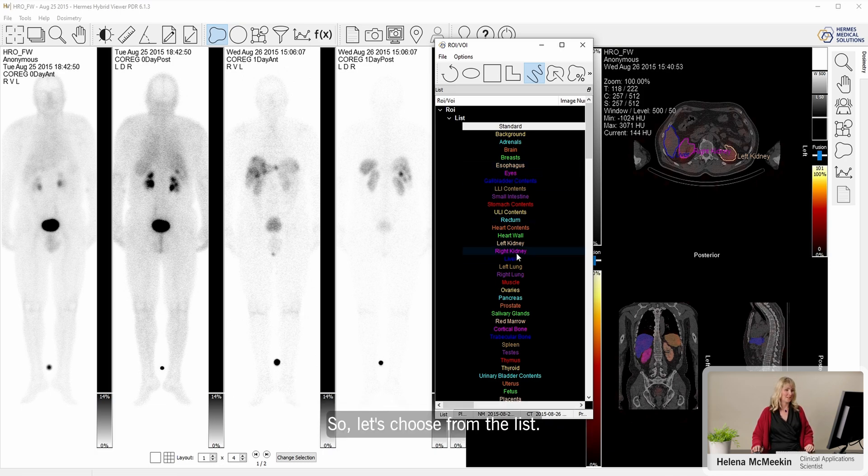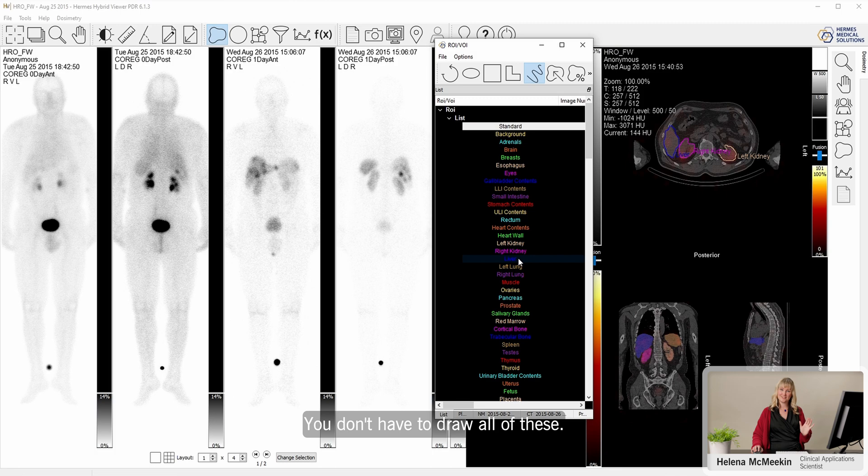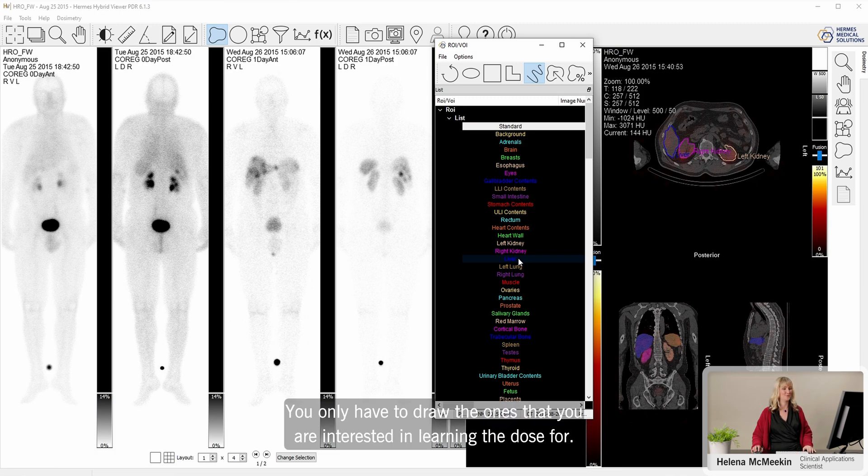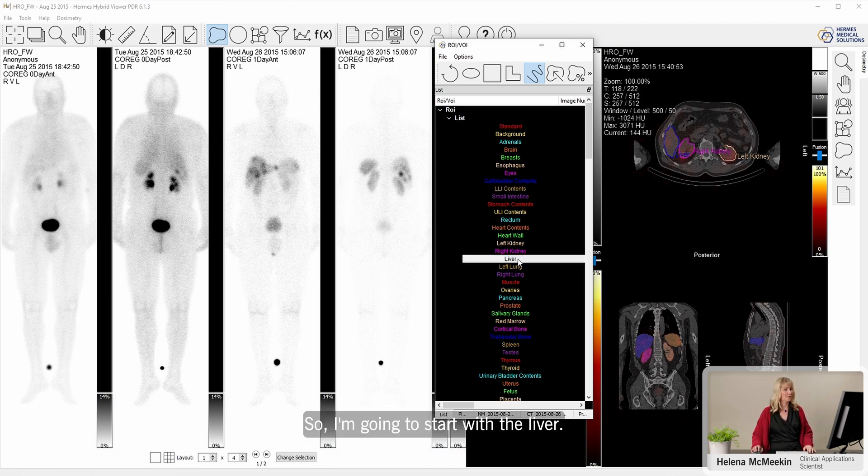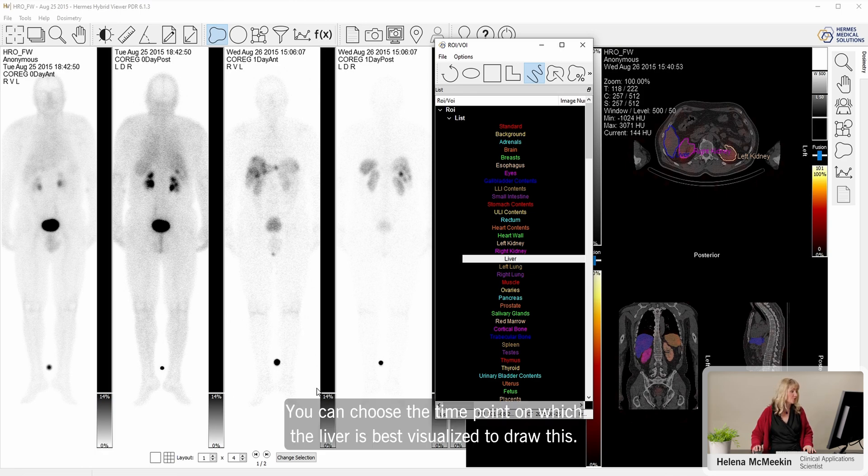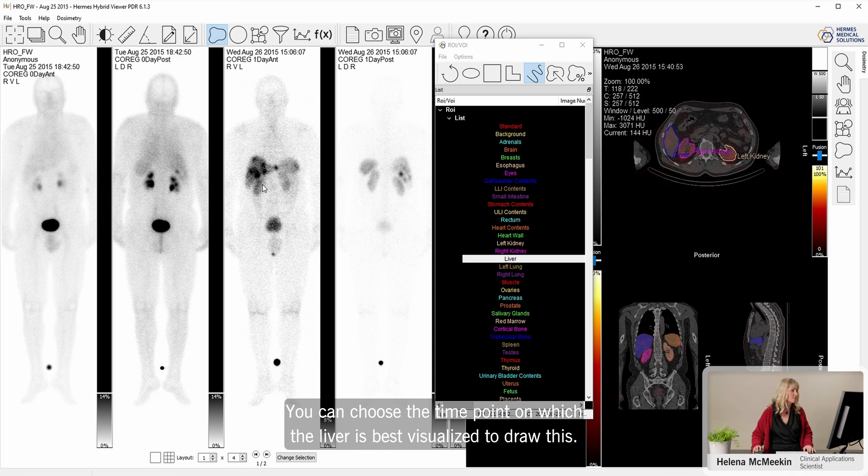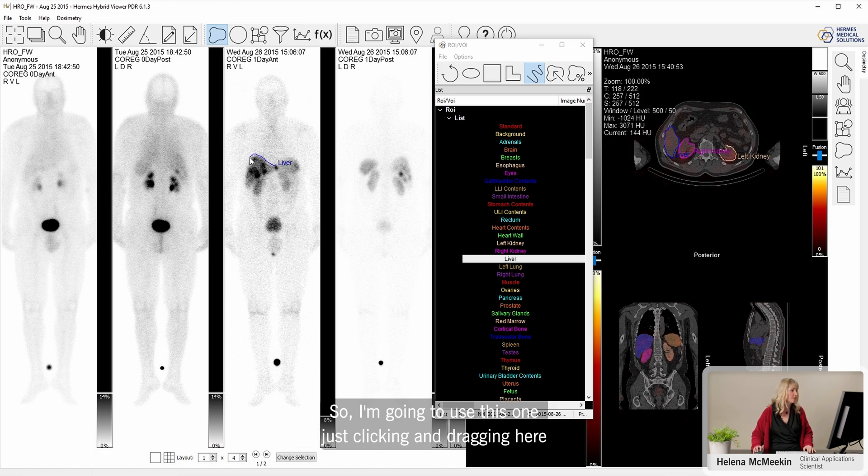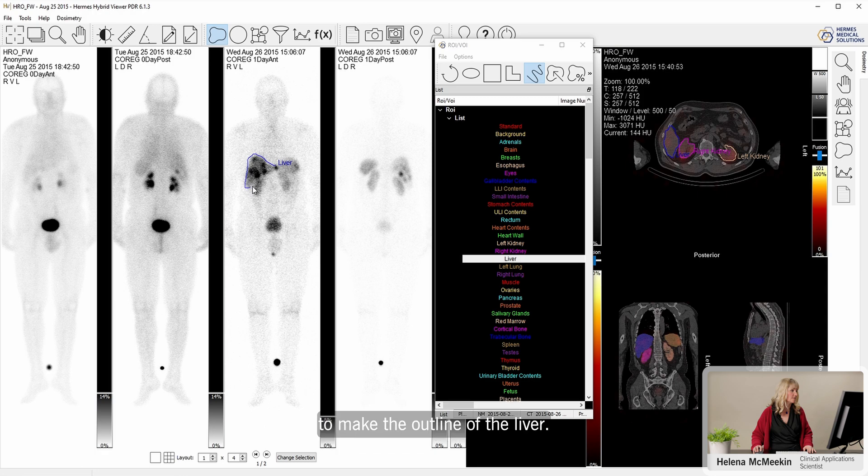Let's choose from the list. You don't have to draw all of these. You only have to draw the ones that you are interested in knowing the dose for. So I'm going to start with the liver. You can choose the time point on which the liver is best visualized to draw this. So I'm going to use this one, just clicking and dragging here to make the outline of the liver.